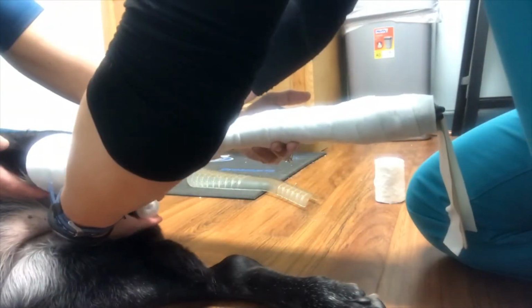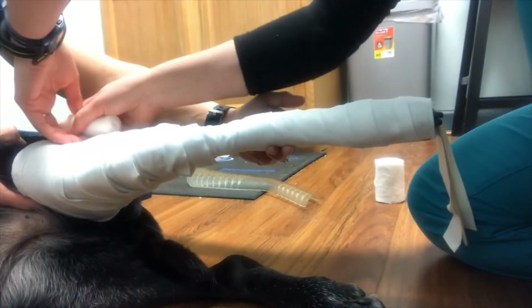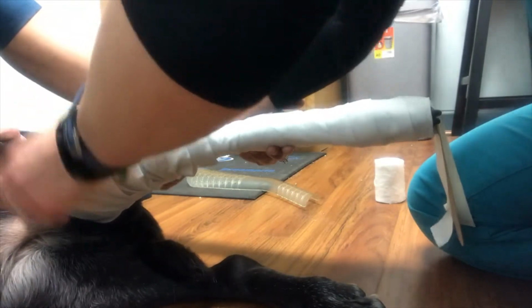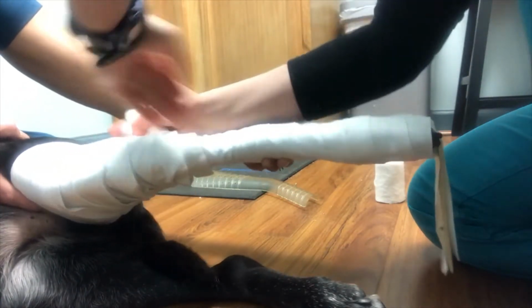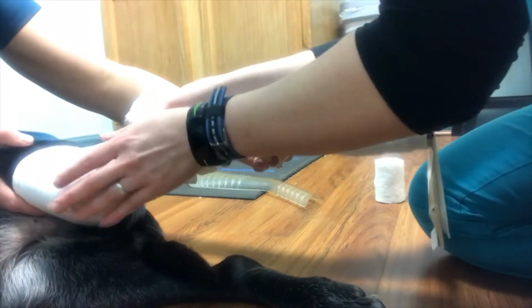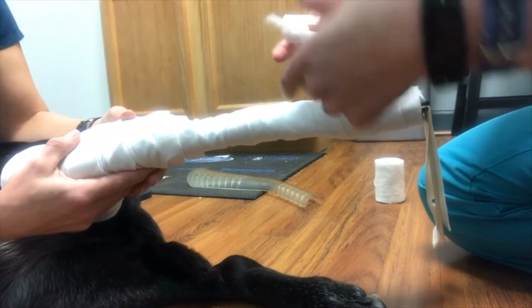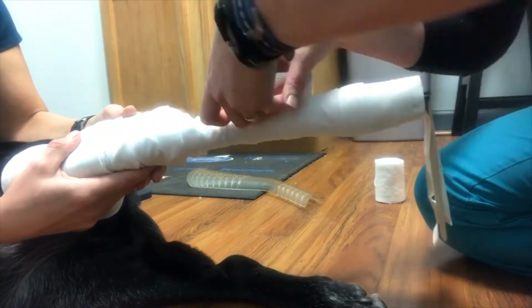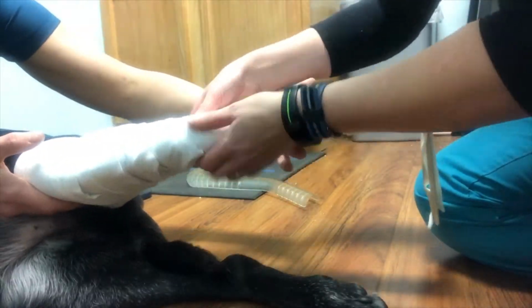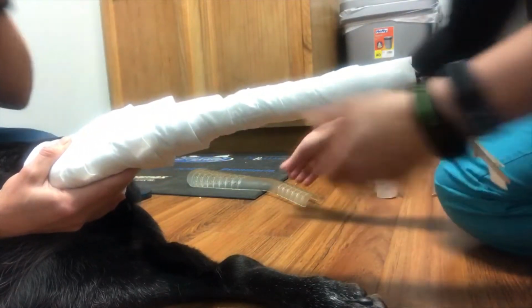Do a little wrap up here. Higher up the leg, I'm going to pull it a little bit tighter since it's naturally going to loosen. Pull off that first layer. Make sure there's not any cotton left sticking out the edges that would be tempting for someone to pull out, and I'll start my second layer, so the patient doesn't pull at those tufts.